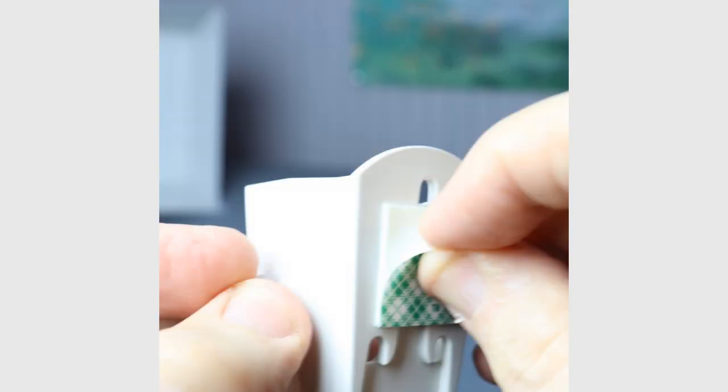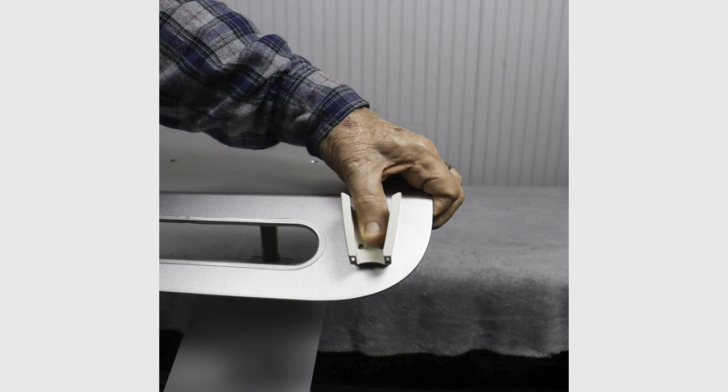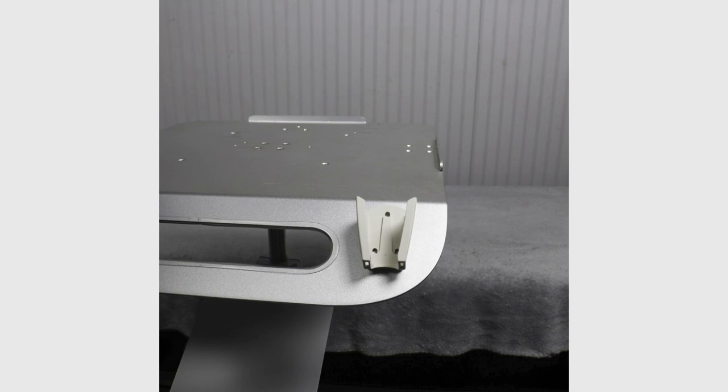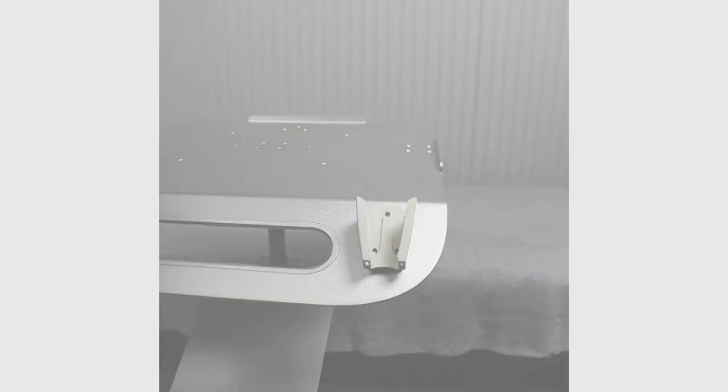Peel off the protective paper from the double-sided foam tape on the back of the remote caddy and place on the left side of the computer tray. Press down with moderate pressure for about 10 seconds to secure.